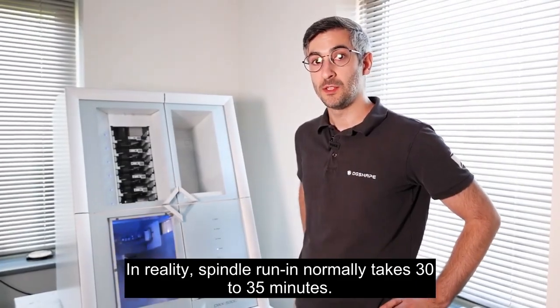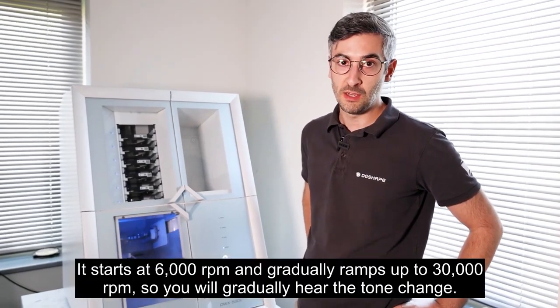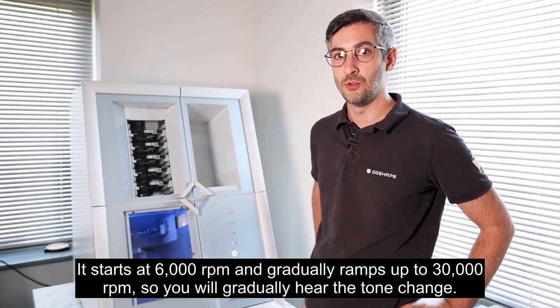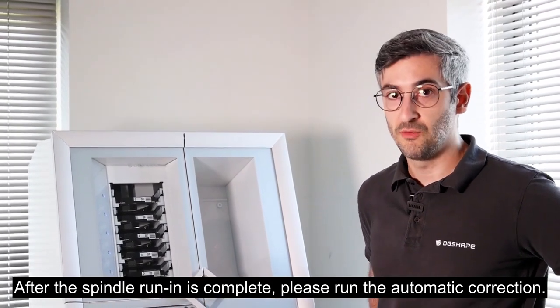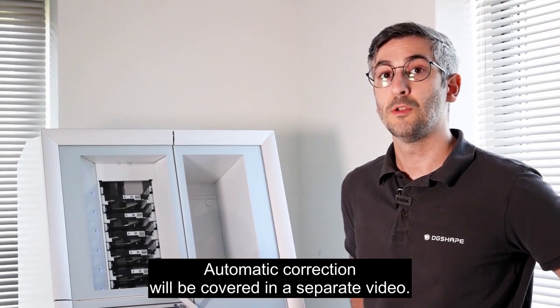In reality, spindle run-in normally takes 30 to 35 minutes. It starts at 6,000 RPM and gradually ramps up to 30,000 RPM, so you will gradually hear the tone change. After the spindle run-in is complete, please run the automatic correction. After that, the machine will be ready to use. Automatic correction will be covered in a separate video.